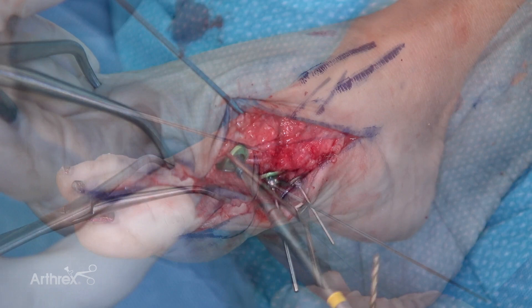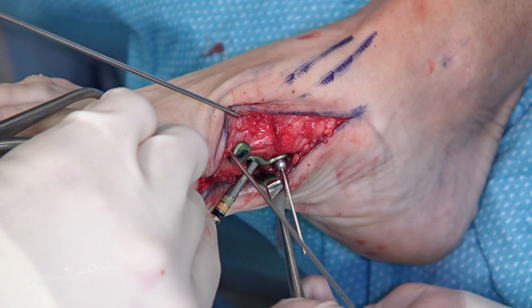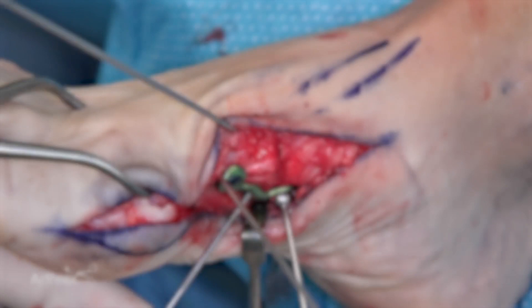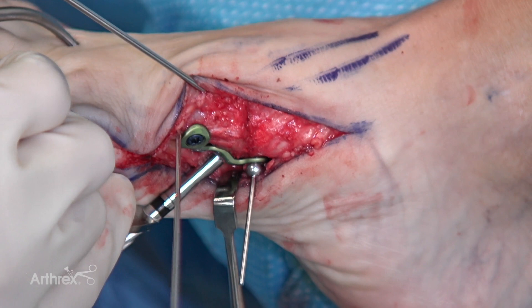We're ready to do our drill for the compression screw. When you're placing the compression screw, seat this in the compression hole within the plate. As far as angling this, you want to shoot somewhat towards the navicular-cuneiform joint — I like to come out just above the NC joint. I also like to stay in the medial cuneiform if you can, shooting for the proximal aspect of the cuneiform on the lateral side in that corner. So the superior proximal lateral aspect is the landmark I'm shooting for. I'll often insert a little K-wire just to keep my angle as I get ready to do the overdrills — this is simply for the first metatarsal. Holding our angle, just a couple of millimeters in — we don't want to rob any purchase of the 4-0 screw in the medial cuneiform.